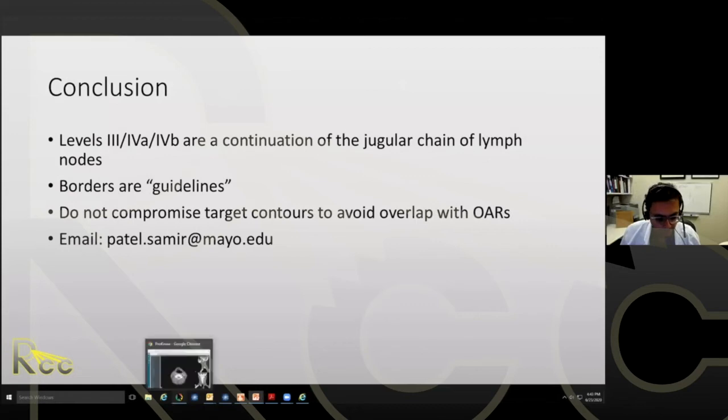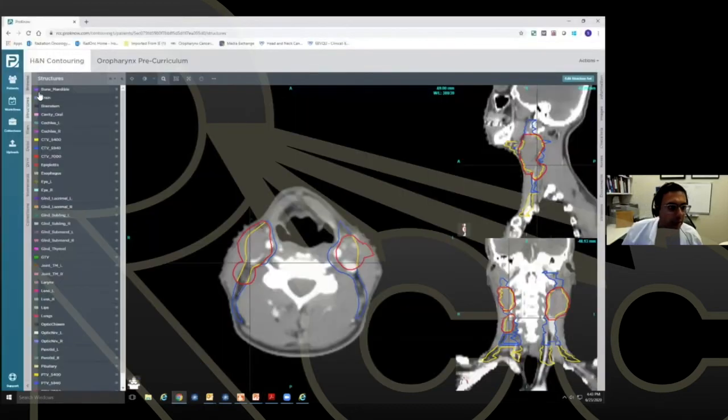Now I'm going to pull up the cases here. I had one case already pulled up, but actually let me go back to make sure I pulled up the right version here.